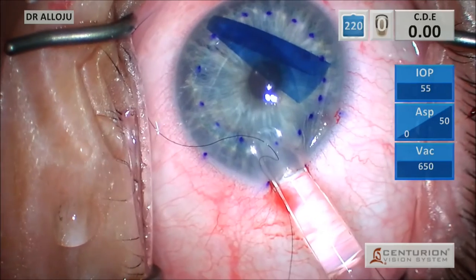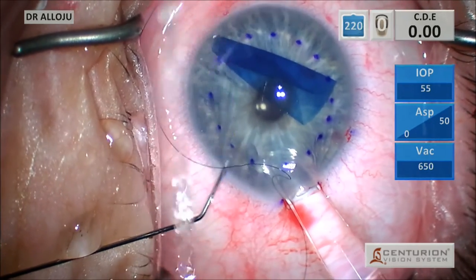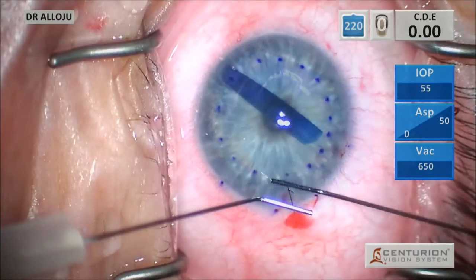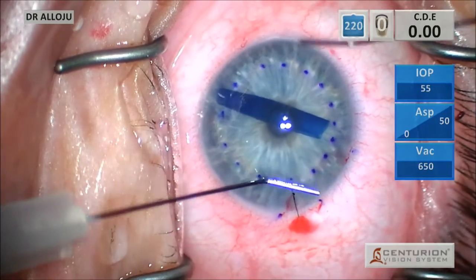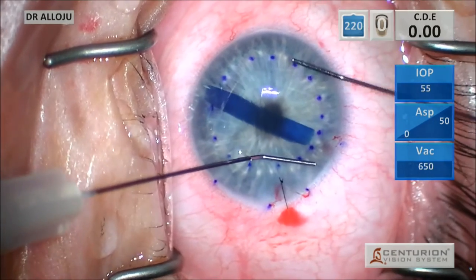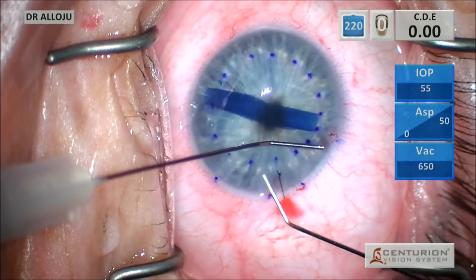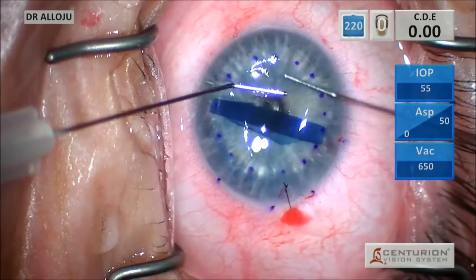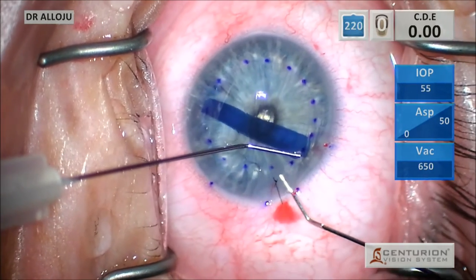Now, once I've slowly injected the graft in, you want to decompress the anterior chamber as much as possible, and I like to use my BSS cannula there just before I come out to help prevent any kind of graft extrusion. Now then I basically tie my suture, and we start our process of trying to get the graft oriented. I find that orienting the graft in a vertical fashion before you get it to unfold has worked the best for me.